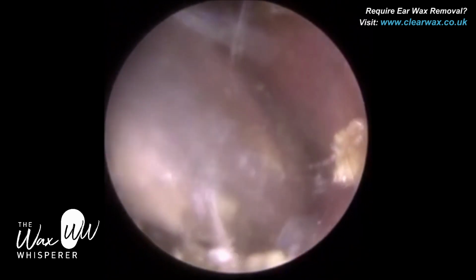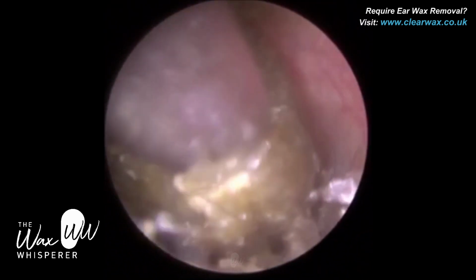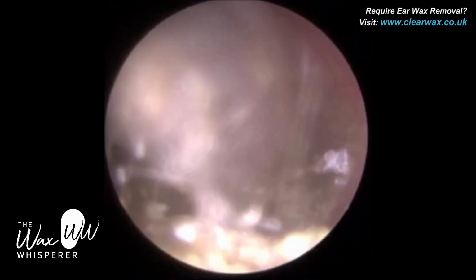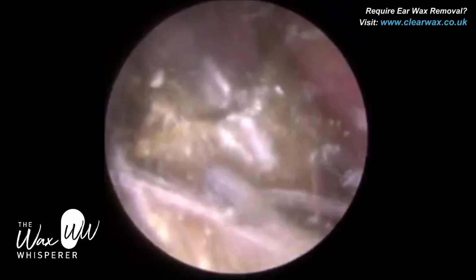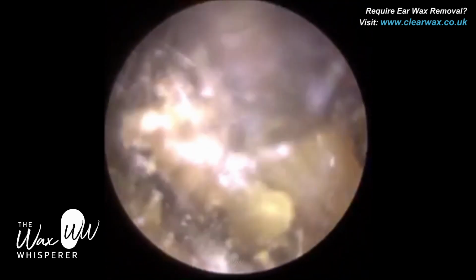So I'm just on the posterior canal wall. You just saw what I did there. I just released this plug of wax and the skin that was attached to it off the posterior canal wall. And that frees up, it mobilizes this plug of wax, and I'm just trying to wriggle it through. We have two bends in the ear. This patient's second bend is quite prominent, so I'm just trying to navigate this around the second bend.